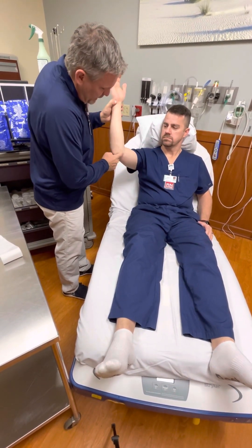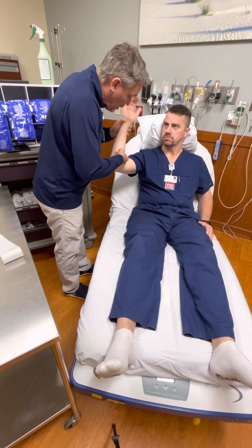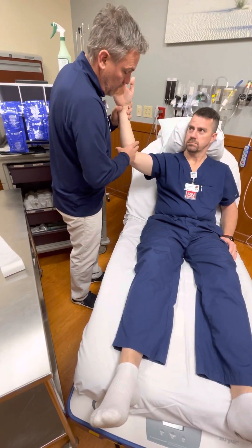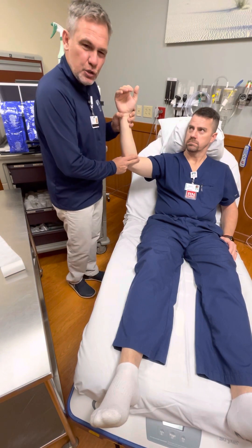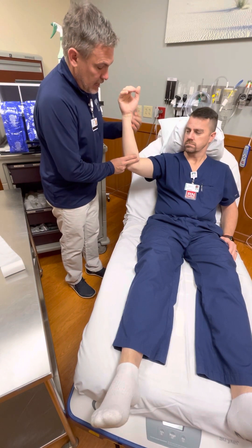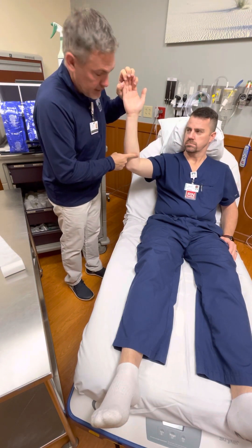Not all the way to this bony prominence down here. I also want to be careful when he bends his elbow - I don't want a piece of material right in the crook of the elbow where he's going to be pushing it into his arm. It's got to be far enough away. Typically I like to use two fingers from the distal part of the elbow, two fingers down to that point, then all the way up to where he can wrap his hand around - here to here in his case.